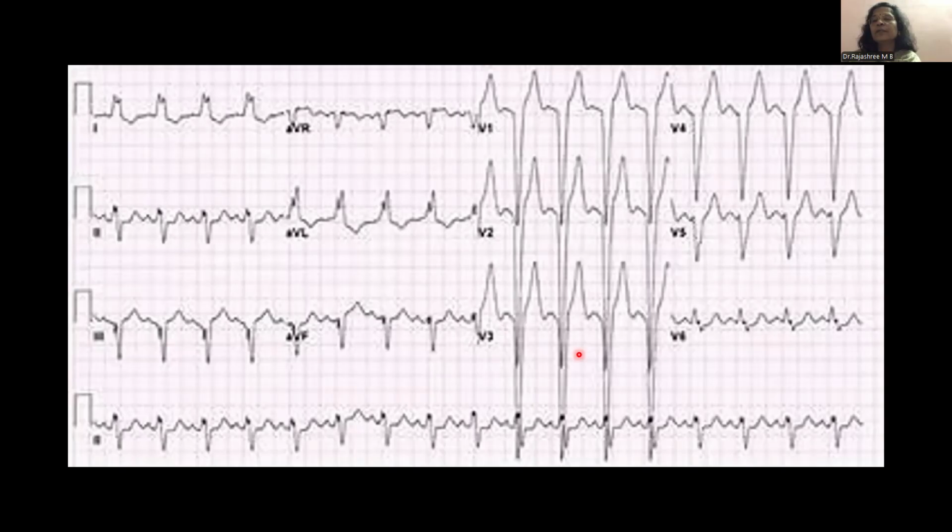Is it a narrow QRS or wide QRS? It's a wide QRS. So what is the disease? What problem does he have? There is a delay, sir. Wide QRS. It's like having a conduction block, sir. Conduction block. Excellent. Somewhere the block is there. It is a right bundle, left bundle, all those things. You will learn it in the next 2-3 classes, you will diagnose where the block is. Today, as of now, it is a conduction block. Everybody is able to appreciate this wide QRS. There are some subtle ST elevations and depressions, agreed, but they will be there in bundle branch blocks. We will learn it later.